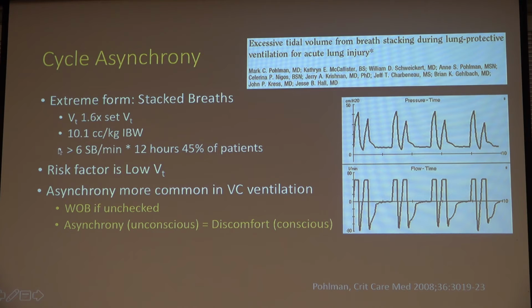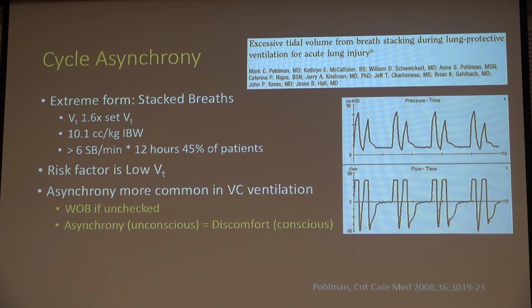A major risk factor for cycle asynchrony is, in fact, low tidal volume ventilation. Again, you're not giving a patient a very, very big breath. They're not going to be happy with the duration of that breath. And also data shows that asynchrony is more common in volume control ventilation. So I've been touting volume control ventilation up to this point. Asynchrony is more common in volume control ventilation. And again, asynchrony can result in increased work of breathing if it's left unchecked.